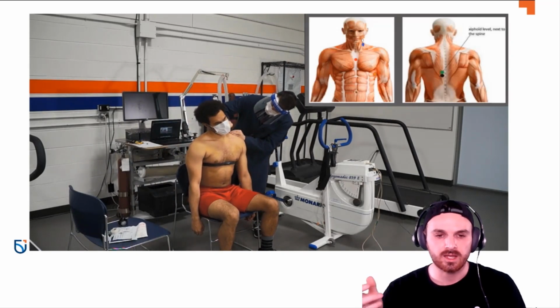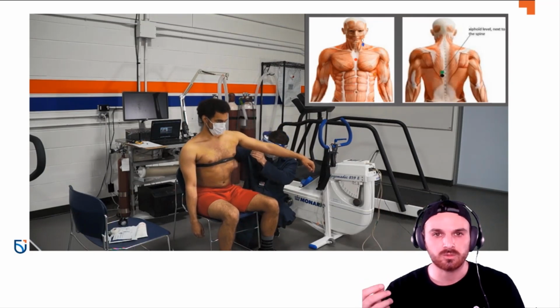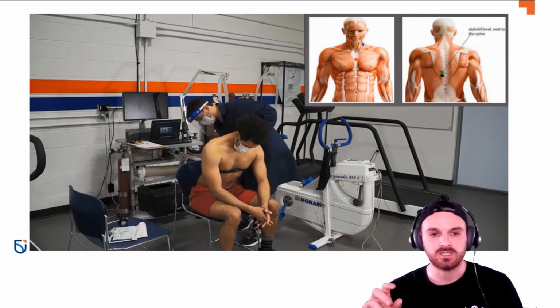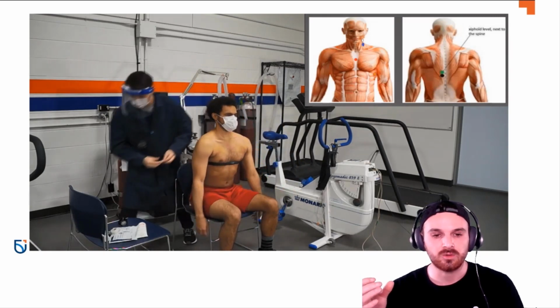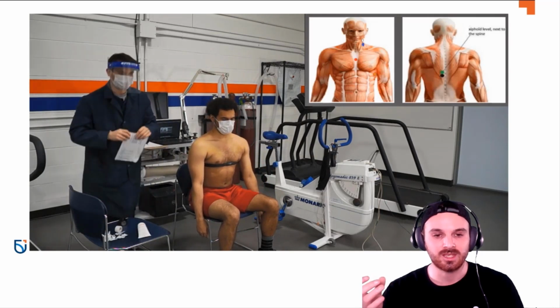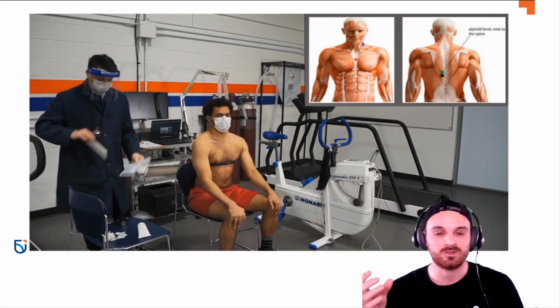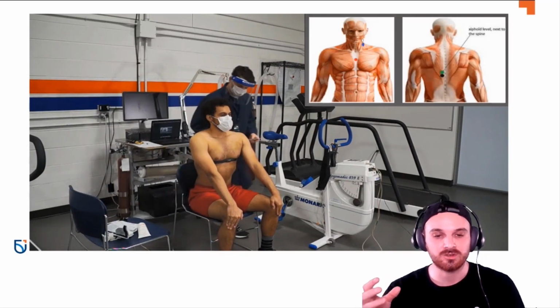With some of the newer EMG and ECG systems, there's not a huge need to really prep the participant. But here, the Physioflow Enduro actually takes these very specialized large wet gel electrodes. I typically don't burn them unless we are doing a full-on test on a client or someone who's coming into the lab. They are about 5 times as expensive as our regular electrodes.